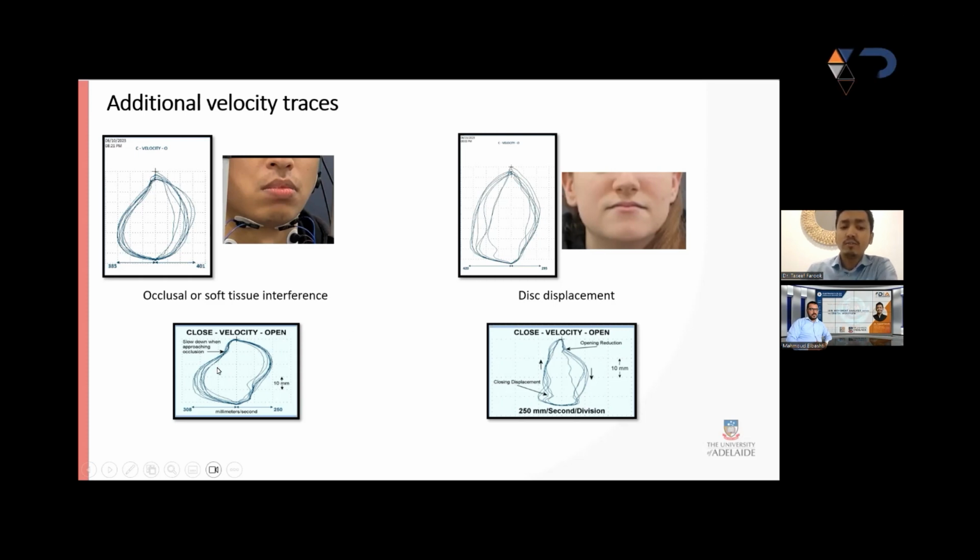And as you can see from the textbook outputs, slowing down during approaching occlusion often means that there is a soft tissue or a hard tissue obstruction. Now, if we move away from the books and go back to the clinics, we will find that this is happening because of the participant's enlarged lower lip. The lip and the anterior malocclusion lead to the teeth and the lip making first contact and the lip slowly gliding in front while the teeth go into an occlusal contact.